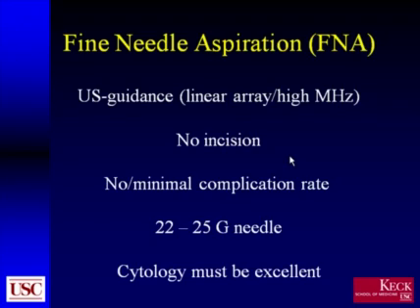However, I think caution must be exercised here in that before you can expect to be able to differentiate these lesions with a fine needle aspiration, you must be certain that the cytology in your institution is excellent. Otherwise, you may need to revert back to core biopsies, because if they can't be diagnosed cytologically, they're going to need a larger specimen. And it is simply not possible in some areas of the world to have cytology that is as good as we're lucky to have at USC.